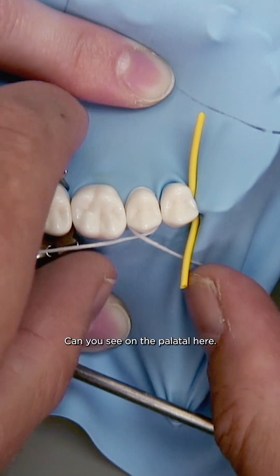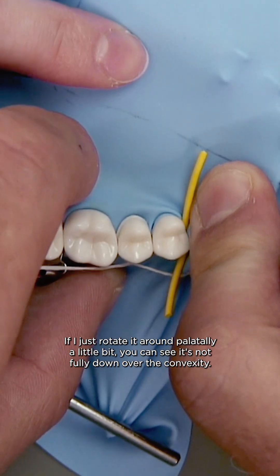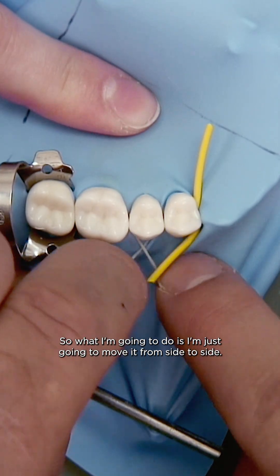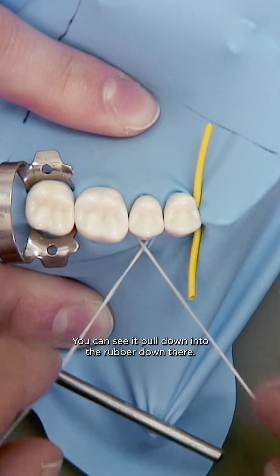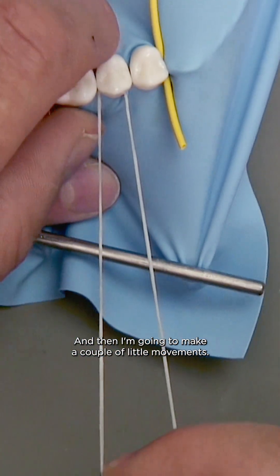Can you see on the palatal here? If I just rotate it around palatally a little bit, you can see it's not fully down over the convexity, so what I'm going to do is move it from side to side. You can see it pull down into the rubber down there and then I'm going to make a couple of little movements.